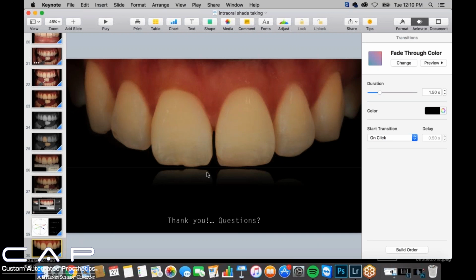I try to keep them at the same angle and the same position for every patient, and I think that's a good idea. Like I said earlier, the brackets can move, and when I'm storing my camera, I fold those brackets up so I can store my camera even easier. So what I do is I take a silver Sharpie, and when I find that perfect position, I mark it with the silver Sharpie so I can put it back to that same position.